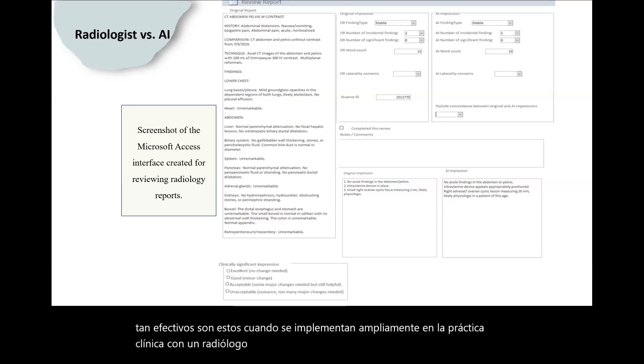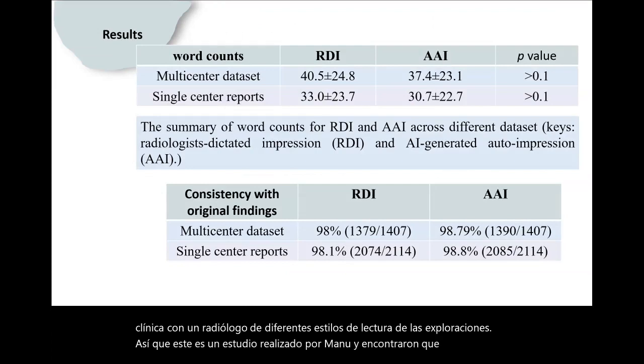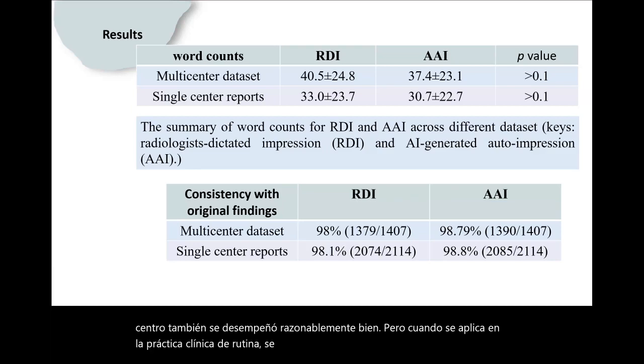So this is a study done by Monu, and they found that in a multi-center dataset, it was performing very well. And also in single center reports, it performed reasonably well. But when you apply it in routine clinical practice, it falls short of the expectations. But as I said, it's still a work in progress, and hopefully in future, the results will be better.